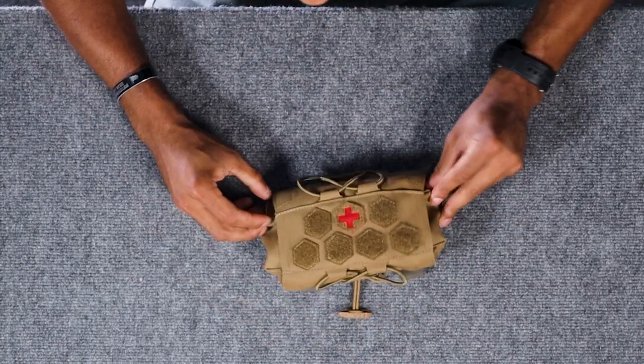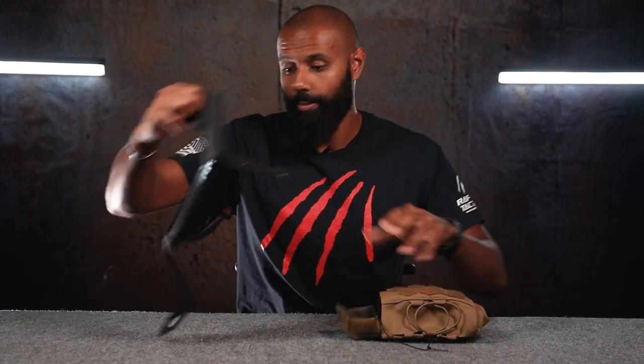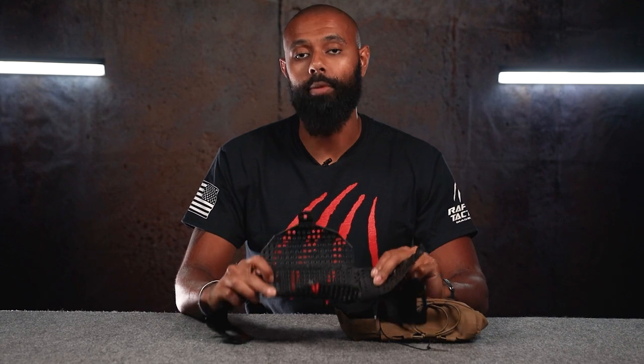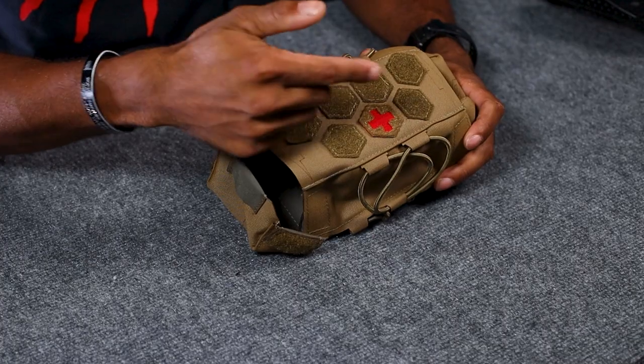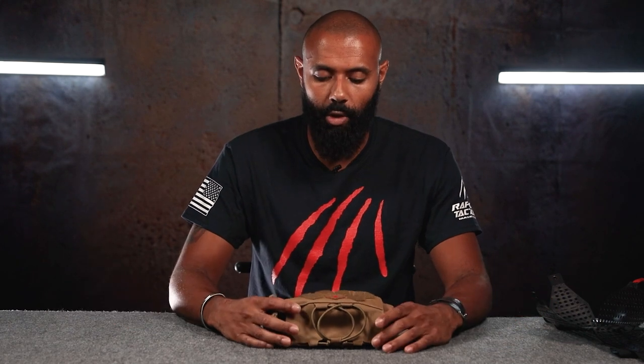There's your MIFAC completely configured. Whenever you need it, you just come in here, rip this out, rip that, and now your insert comes out completely. Everything pops out and opens up, and now you have access to all of your medical equipment. Also, on the outside of the MIFAC, we have the little Velcro pattern here, in case you want to put some patches on it. Something else we did was mark it as a medical pouch. I see a lot of IFACs that aren't marked — it makes sense to mark it as an IFAC so people know which pouch to reach for whenever you get shot.